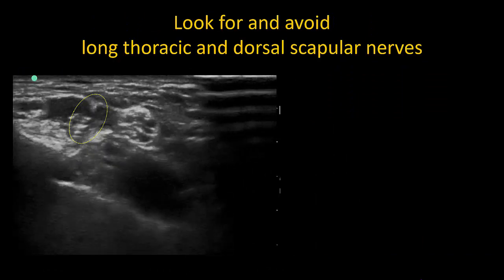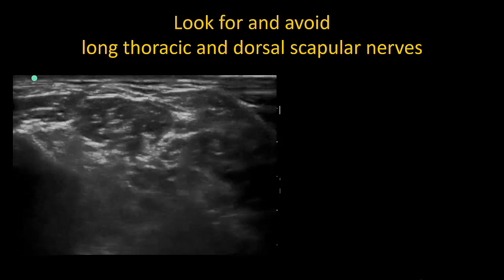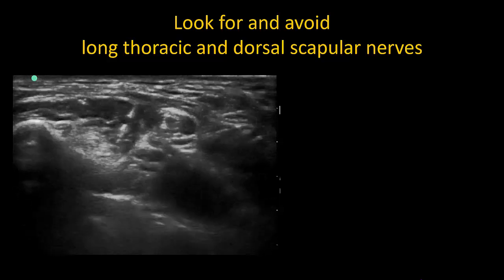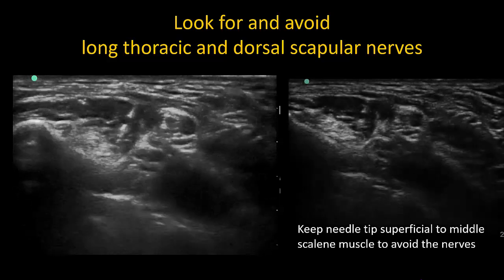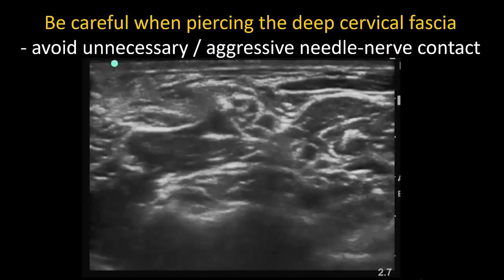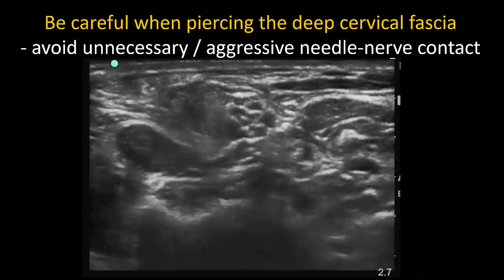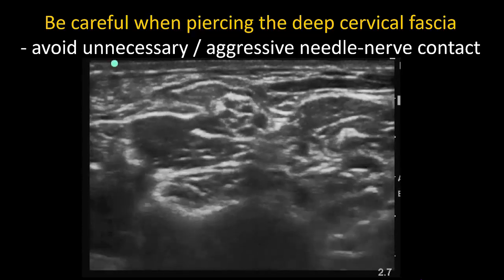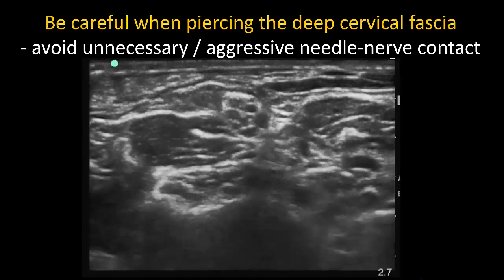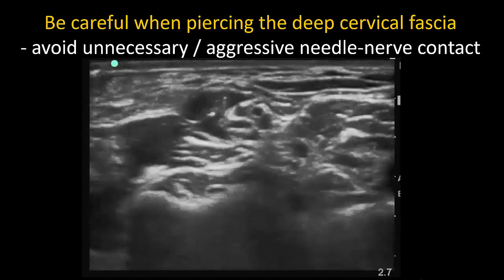It is also good practice to look for the long thoracic and dorsal scapular nerves, which run through the middle scalene muscle and can be at risk of needle trauma. They can be easily avoided in the superior trunk block, which does not require needle passage through the muscle. The needle tip should always be advanced superficial to the muscle and just under the deep cervical fascia. Note how in this example the needle is threatening to glance off the deep cervical fascia and slide into the superior trunk. Using a steep needle trajectory makes piercing the fascia easier. Aim away from the superior trunk, and once through the fascia, use hydrodissection to open up the paraneural space around it.